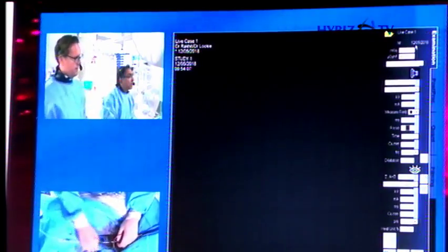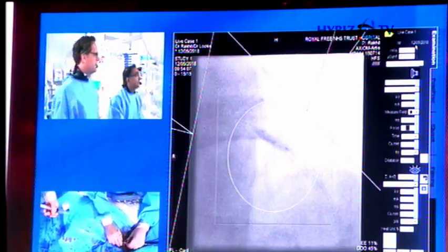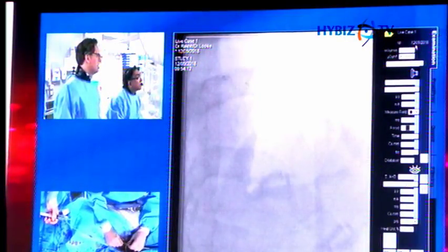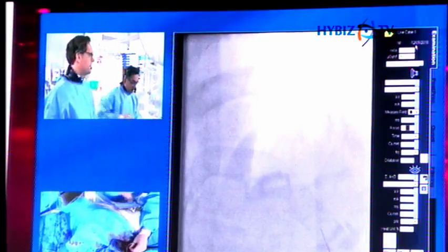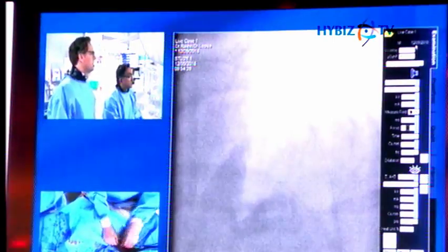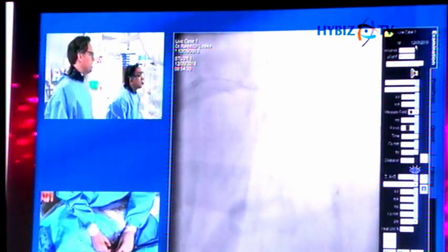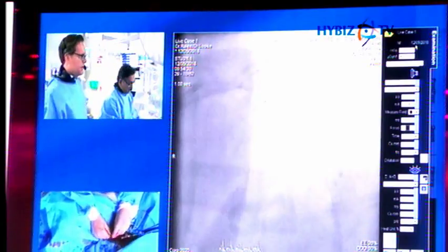And down. So we're hoping that when we measure it, the stent diameter will be considerably bigger than the 5mm that we've post-dilated it to. In fact, Robbie, on Supermag, just do an acquisition with no contrast, just to look at the stent. I don't know whether that projects, but you can start to see the front end of the stent is really looking very big. It looks great. Can you appreciate that?